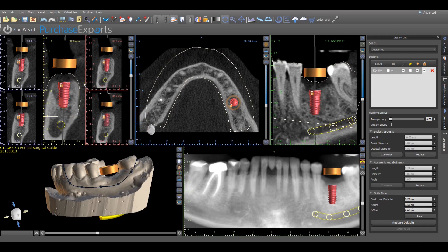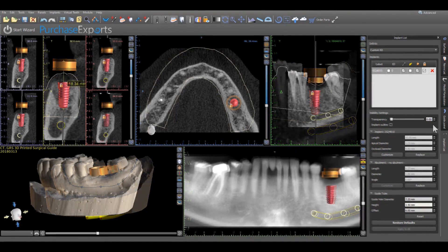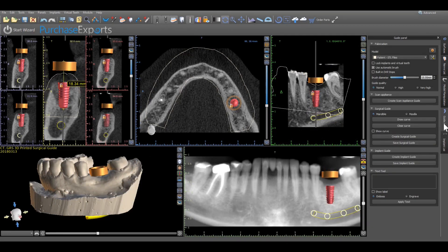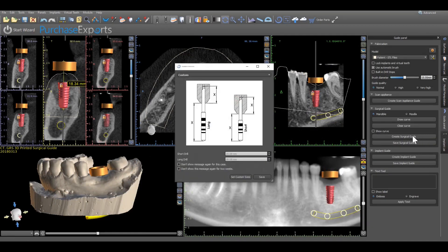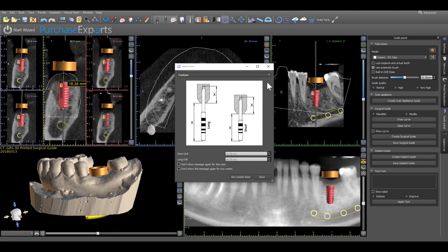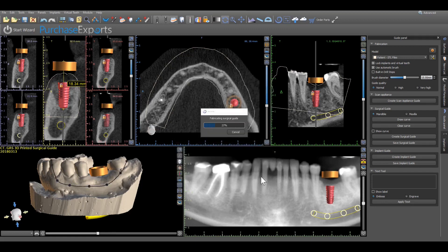Once the surgical guide design is complete, simply click on the guide panel tab and then click create surgical guide. If a handpiece preference is needed to establish the length from the tip of the drill to the head of the handpiece, locate the specific handpiece from the drop-down list and click save. If this is not a required element, keep the drop-down list on custom and click save. The guide fabrication process will automatically begin.